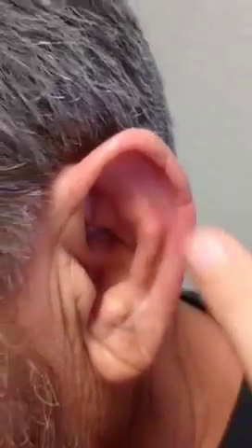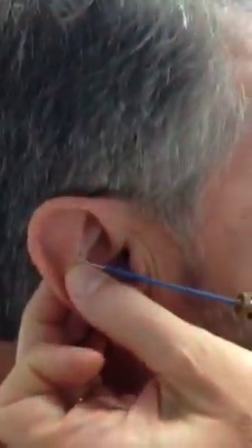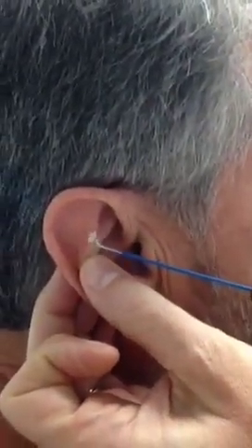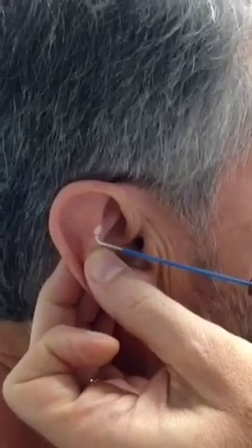This one here is very hard to see — you feel it more than see it. It's a roughness to the skin. The one that will probably be best for the camera is on the left ear, on the anti-helix right here. We're going to go ahead and start the treatment. There are three lesions, which means a total of six sprays. We spray to get it white, which means it's frozen, and I want it to remain frozen for a good fifteen to twenty seconds. Then I come back and re-freeze it after it thaws out.